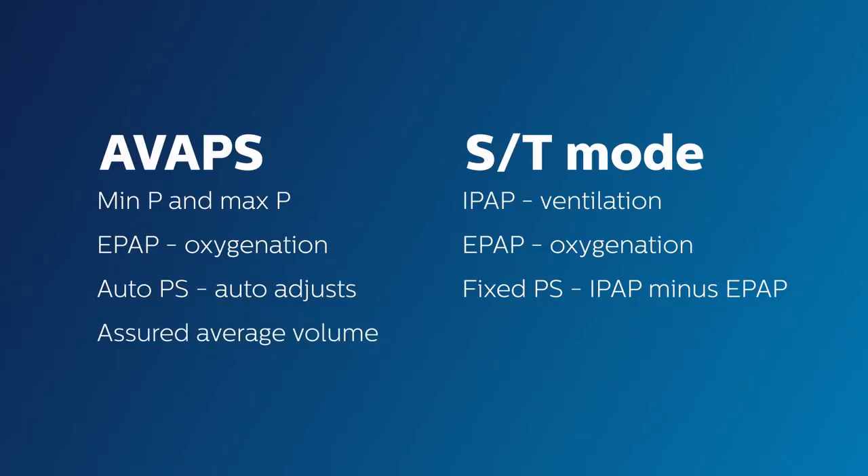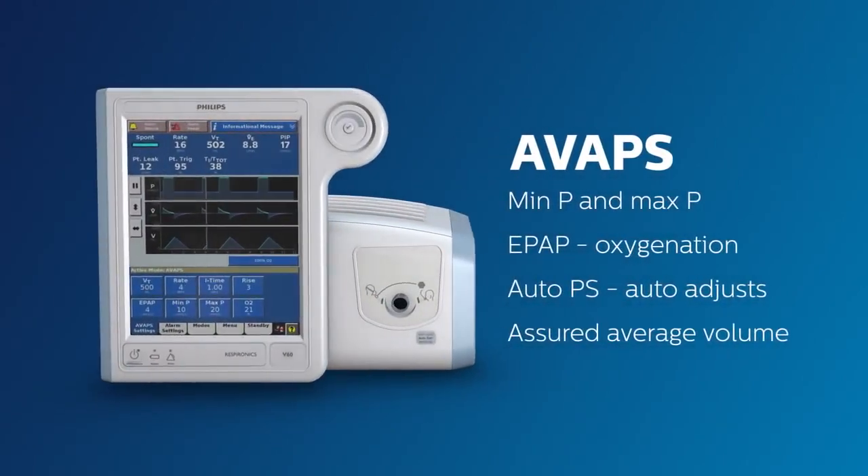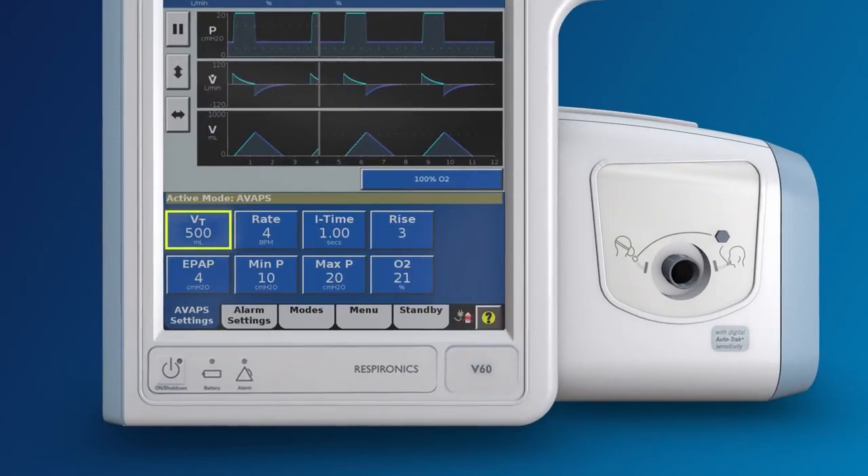In other words, the IPAP will adjust within the set range of pressure in order to deliver the desired targeted tidal volume. On the Philips Respironics V60, you may notice there is no longer an IPAP setting here. Instead, the IPAP has been replaced with a targeted tidal volume setting, and rather than having one fixed IPAP value, you can now specify an IPAP range. In this example, the range is set to a minimum IPAP of 10 and a maximum of 20.